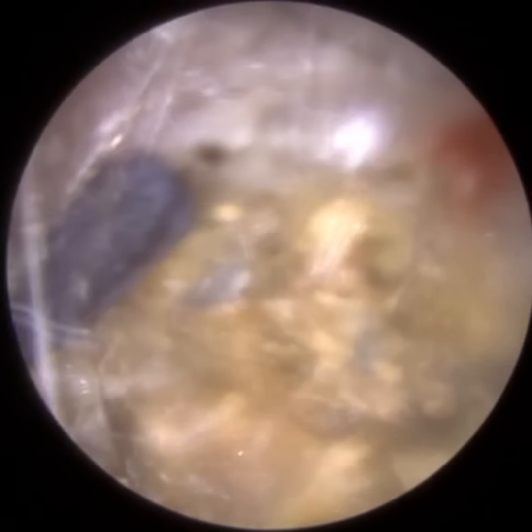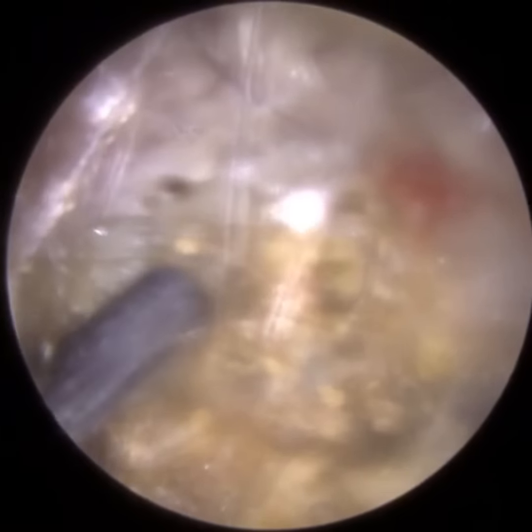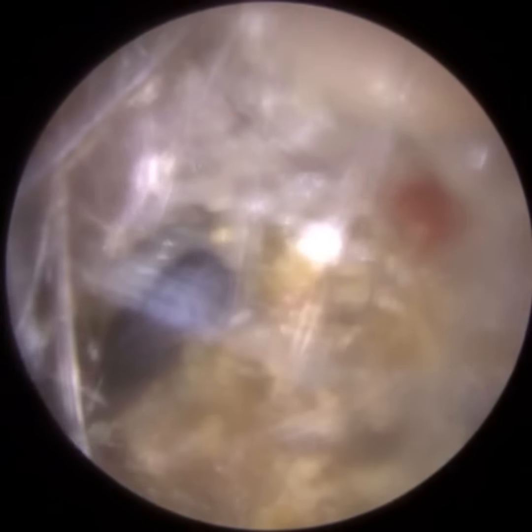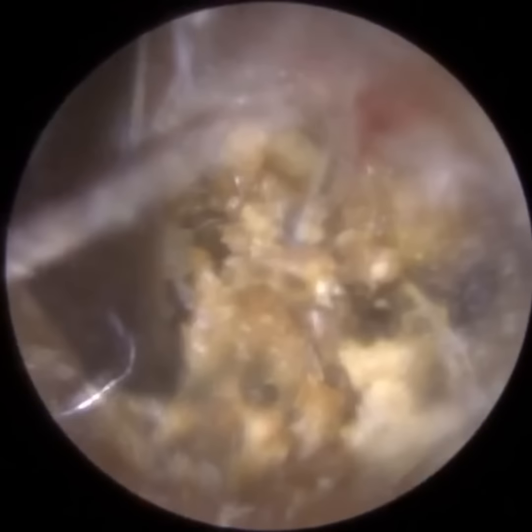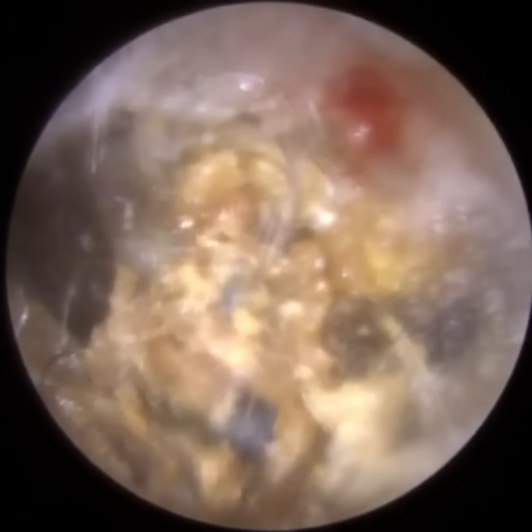So going in with the ear hook, we've got to be really gentle because we are on the bony part of the ear canal. I'm not getting too far with suction, so I'm just trying to embed this into the plug. Sometimes you bring it forwards and it comes out in one big plug, but here it's dissected it. It's like a hot knife through butter.